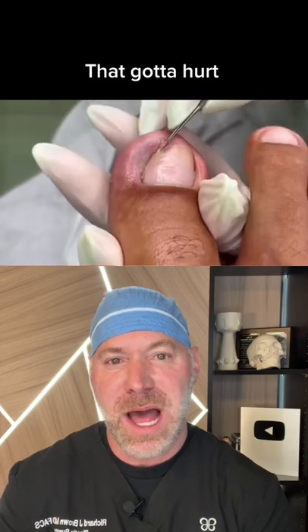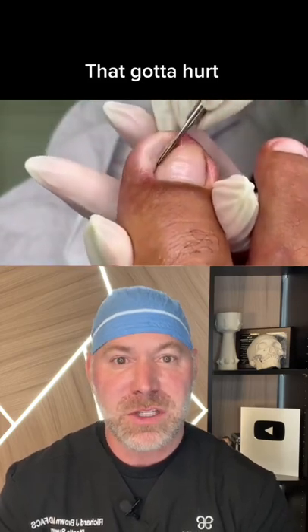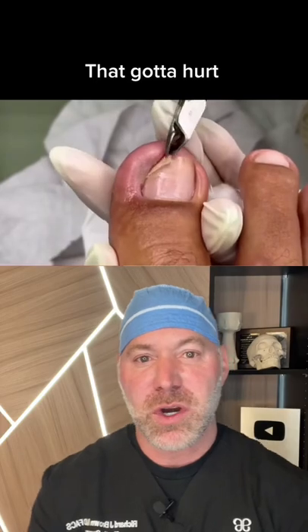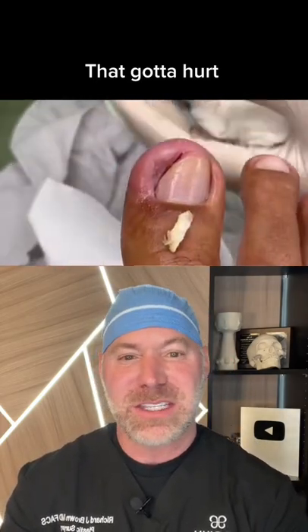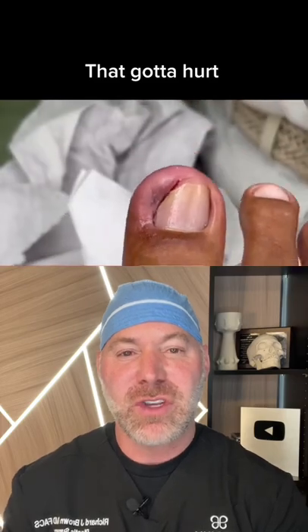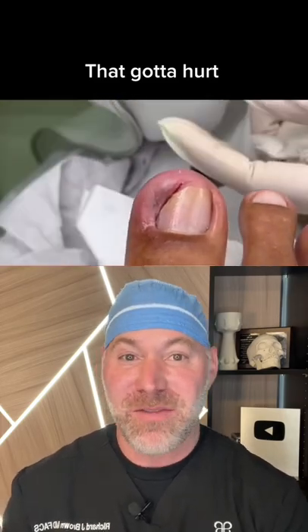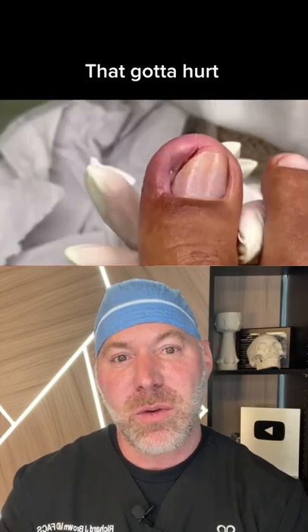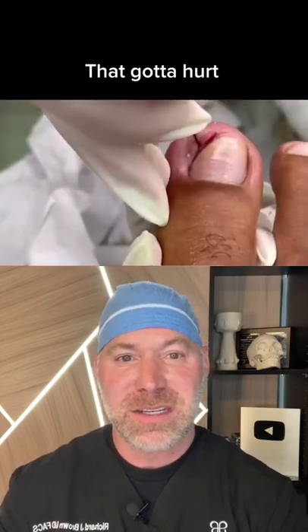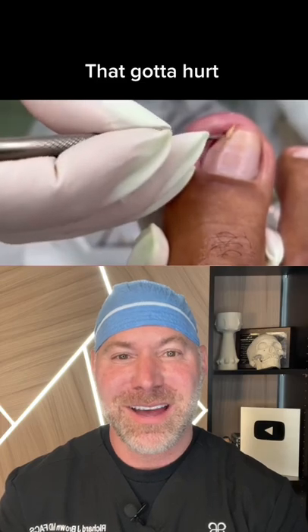What they usually do here is they do a digital block to numb the toe, and they sometimes put a little tourniquet on there. Here they're just clipping it — watch this piece. Wow, that is so satisfying. You just have to know that once they get that out, they feel so much better, and that toenail should grow back as long as the growth plate is intact. Well done, and gloves.